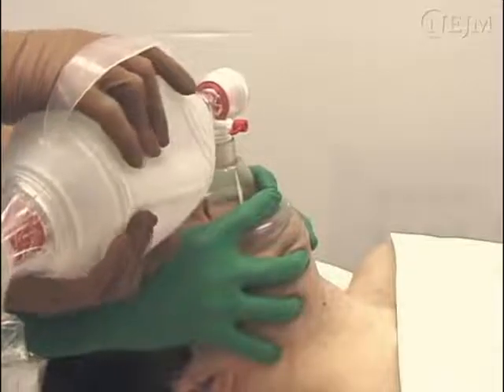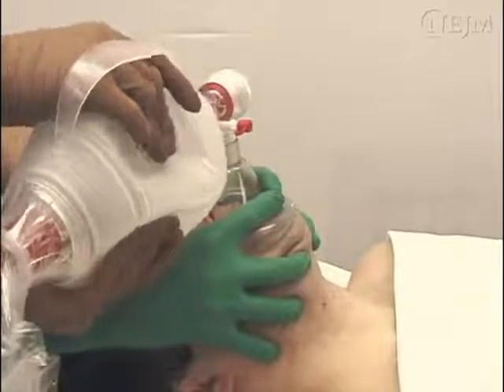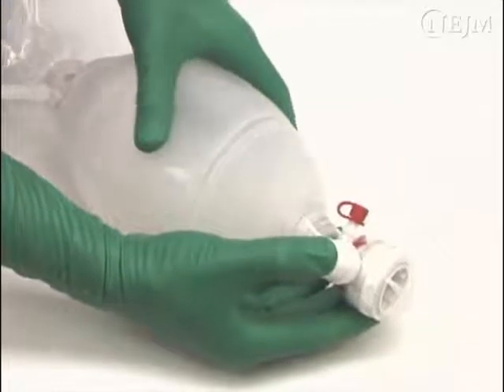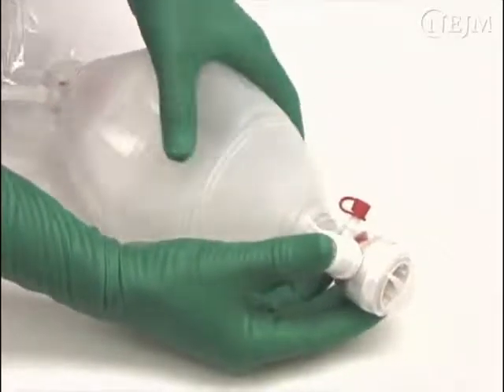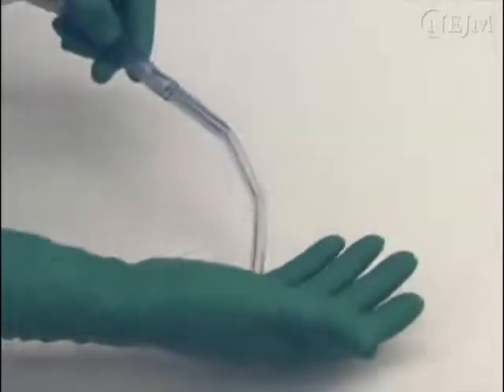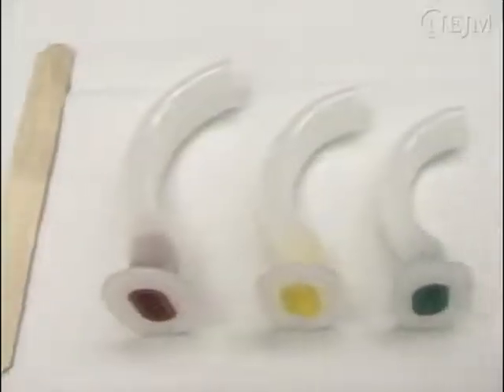A bag valve device's capability for delivering positive pressure ventilation should be tested before use. This can be achieved by sealing the bag valve device connector with the thumb and squeezing the bag with reasonable force. If it is difficult to compress the bag, or if air is forced between the connector and the thumb, positive pressure can be delivered. Whenever possible during face mask ventilation, suction should be readily available. Airway management adjuncts such as oral or nasal airways may need to be used.